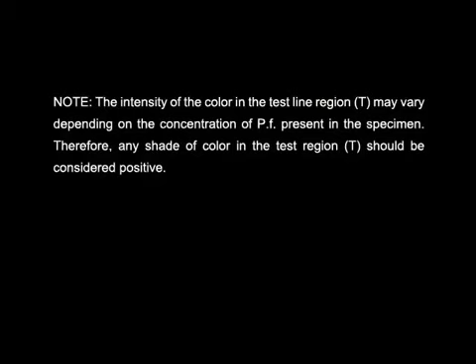Note: the intensity of the color in the test line region T may vary depending on the concentration of Plasmodium falciparum antigens present in the specimen. Therefore, any shade of color in the test region T should be considered positive.